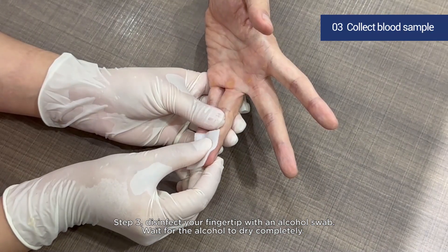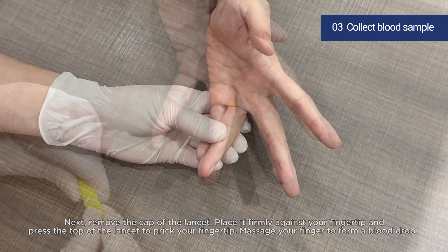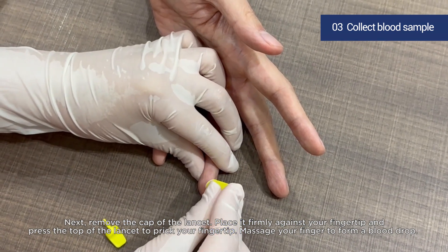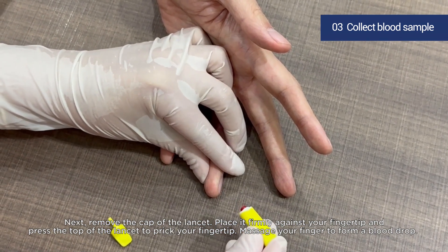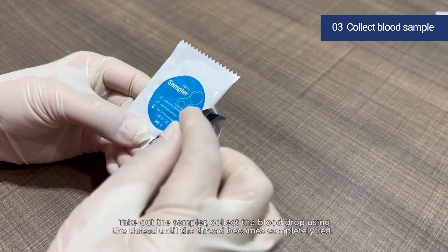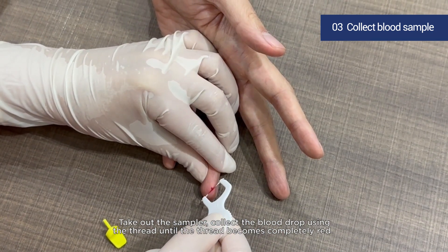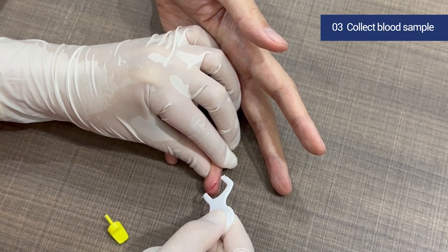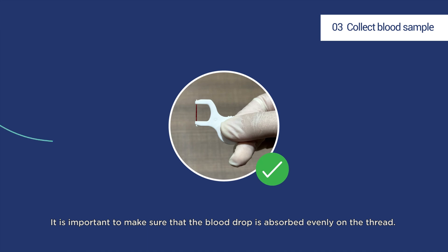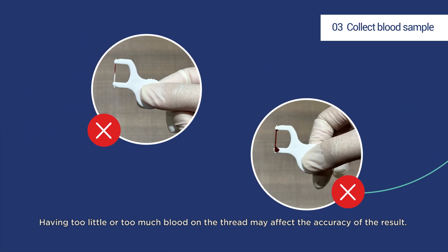Step 3: Disinfect your fingertip with an alcohol swab and wait for the alcohol to dry completely. Remove the cap of the lancet, place it firmly against your fingertip, and press the top of the lancet to prick your fingertip. Massage your finger to form a blood drop. Take out the sampler and collect the blood drop using the thread until the thread becomes completely red. Make sure that the blood drop is absorbed evenly on the thread, as too little or too much blood may affect the accuracy of the result.